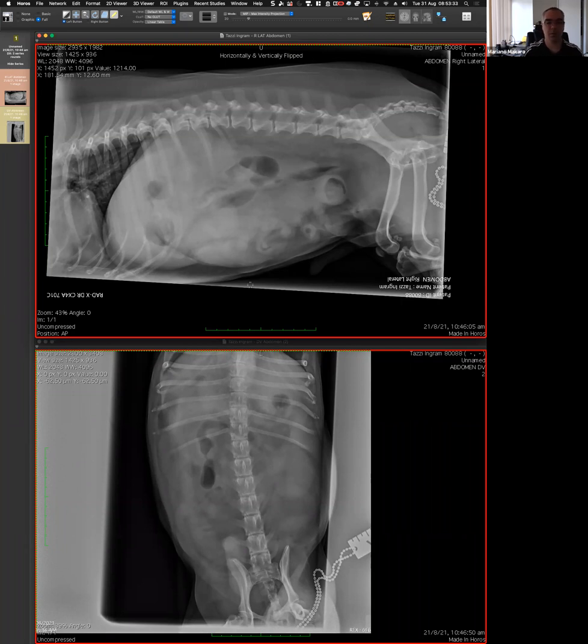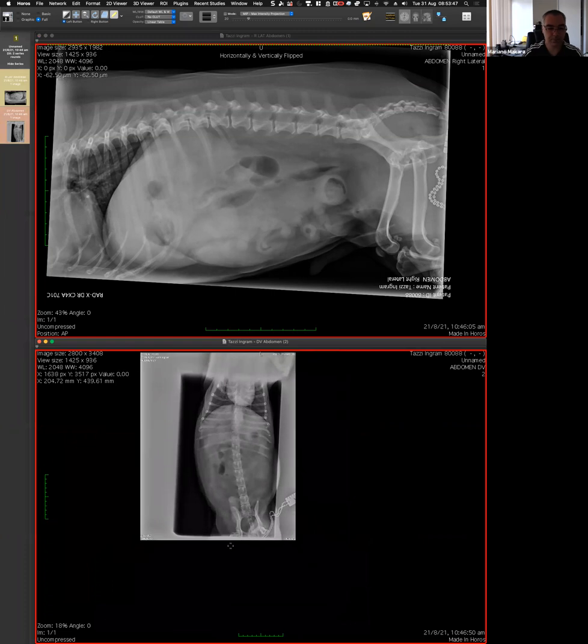I sent it to surgery, whatever. And then probably the thing that, based on experience, now I don't let go. Before I send this dog to surgery, I physically make this image small. And that helps me to see the big picture approach. It's an old dog. I'm sending this dog to surgery. I need to go fishing. You know, then maybe something else.